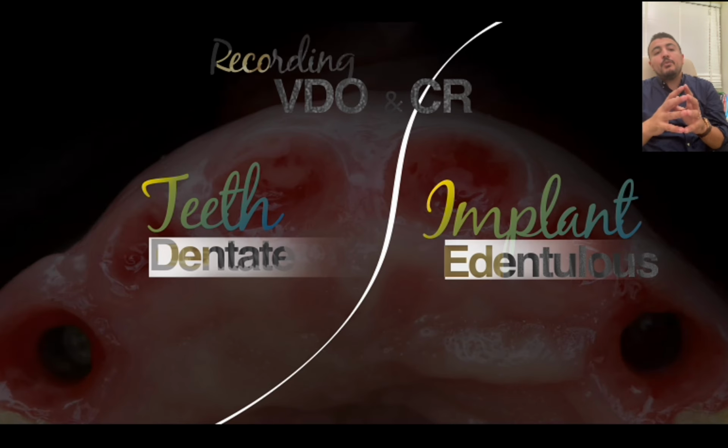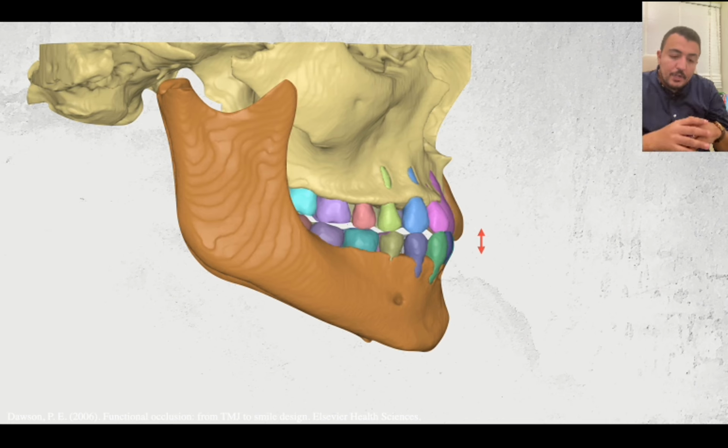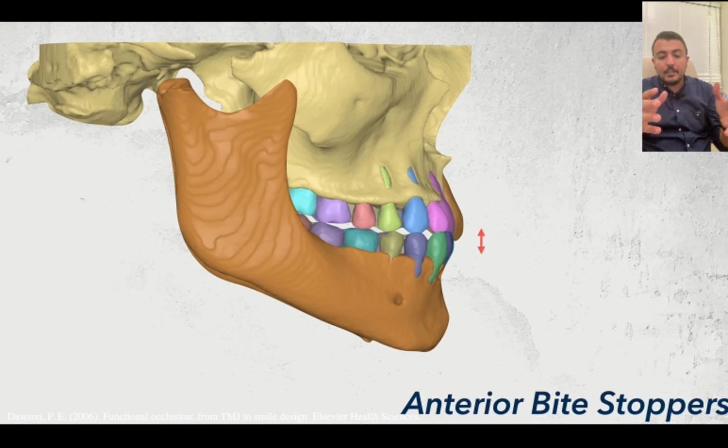So how to record vertical dimension and centric relation in the two main situations, with dentate patients and also with completely edentulous patients for implant prosthetics. Usually, if you want to record the vertical dimension, or raise the vertical dimension, with a dentate patient, we can use a kind of anterior deprogrammer or anterior bite stopper.